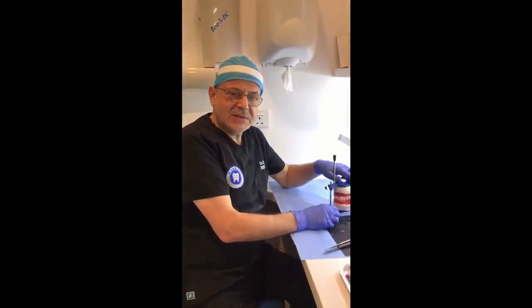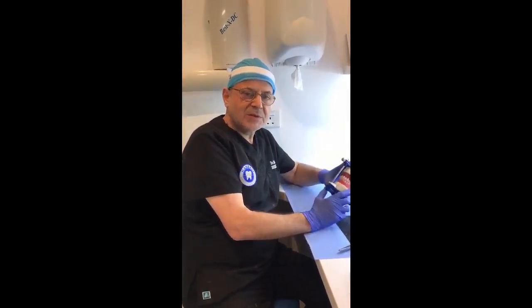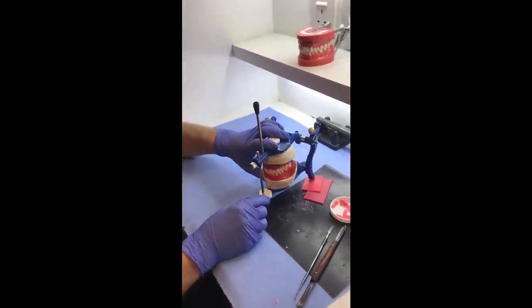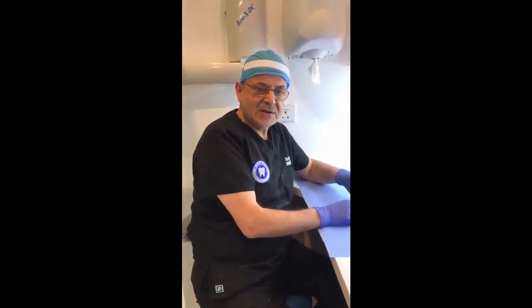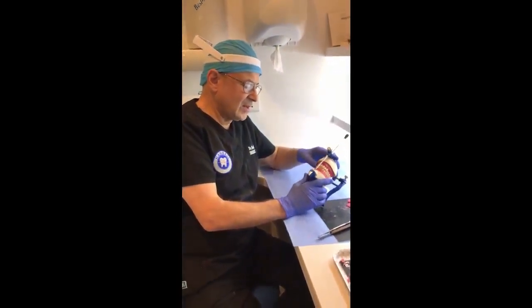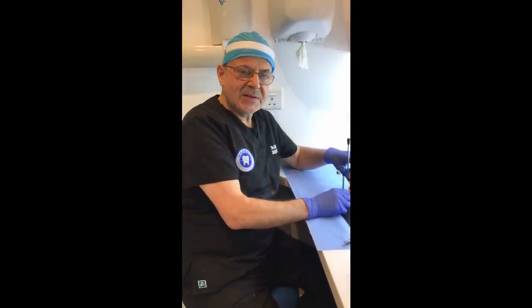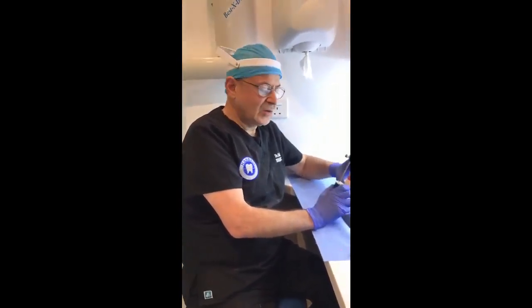Now, after we have completed a successful try-in inside the patient's mouth, we put back the trial denture on the models and we start the final waxing up. Now the trial denture must have the initial waxing up, as I mentioned, the smooth surface of the wax and the clean teeth. Then after we have completed the try-in stage in the clinic, we proceed to the final waxing up of the trial denture on the articulator.